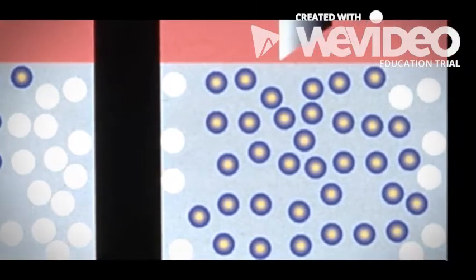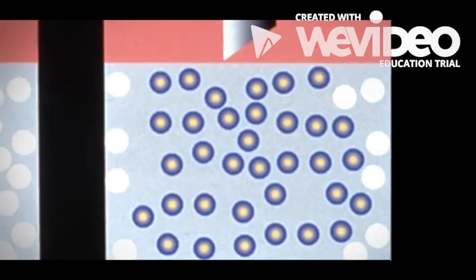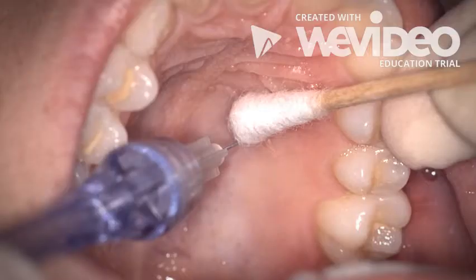We use this for all wand injections. To establish, place the bevel of the needle against the tissue. Apply a cotton-tipped applicator on top to seal the bevel. Without penetrating, initiate the slow flow of anesthetic for 2 to 3 seconds to force some anesthetic through the surface epithelium prior to actual penetration.